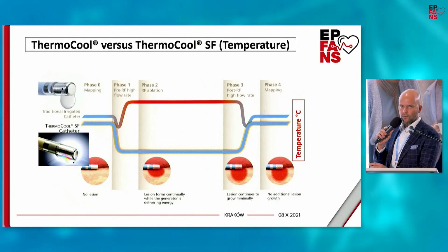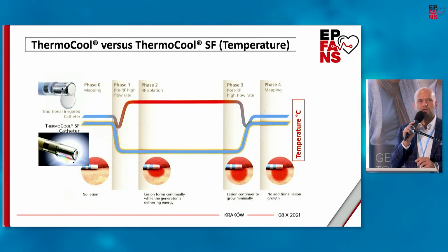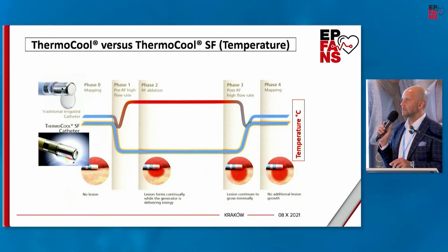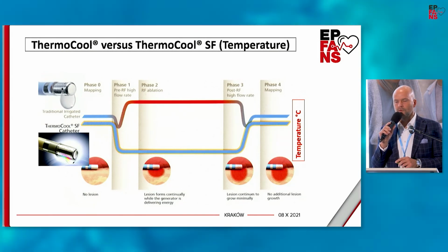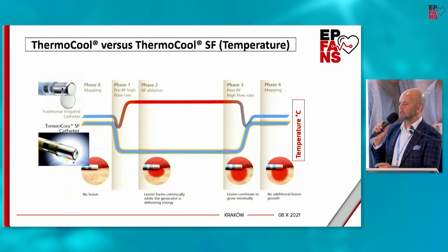So now, as we are aware of all these situations, all these tips and tricks and the phenomena occurring during the ablation, there is a strong advice. Before you start ablation, study catheter characteristics and construction, because there are some small technical differences resulting in different parameter readings.